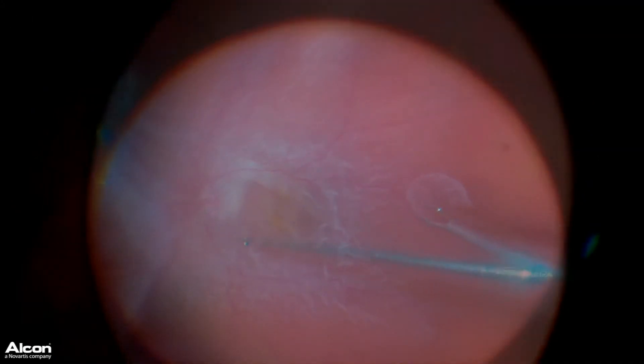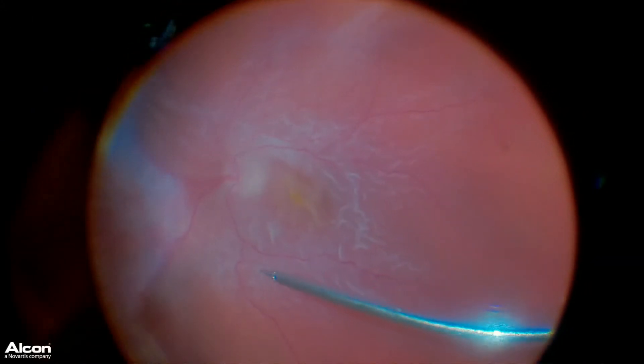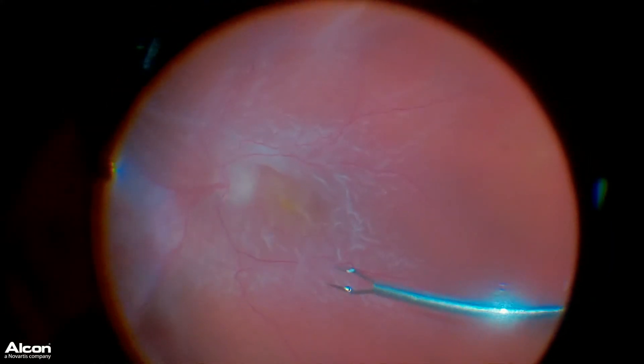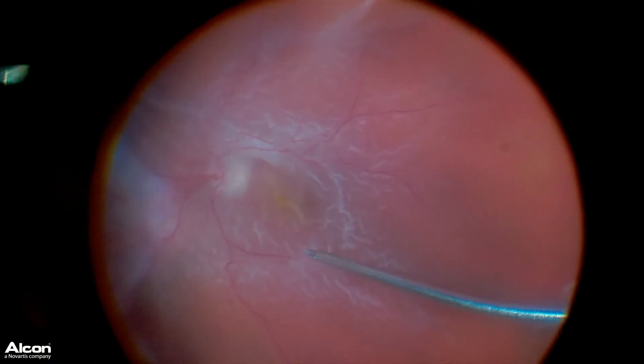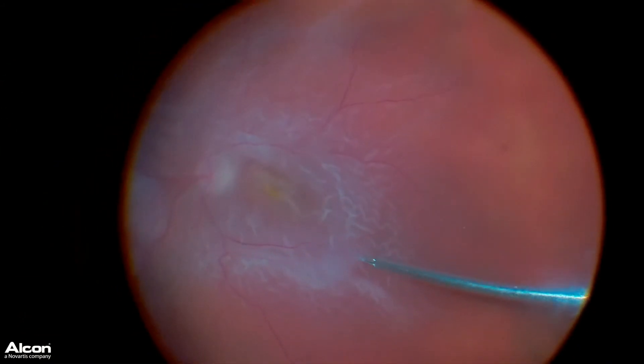Here you can see I'm using MaxGrip forceps and I'm simply peeling this almost invisible scar tissue off the retina to allow the retina to become much more relaxed and pliable.